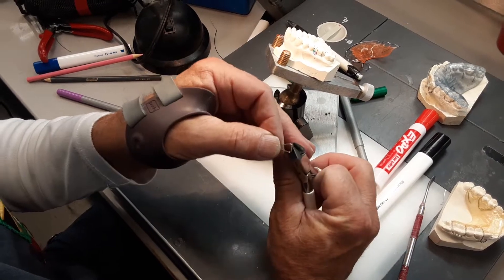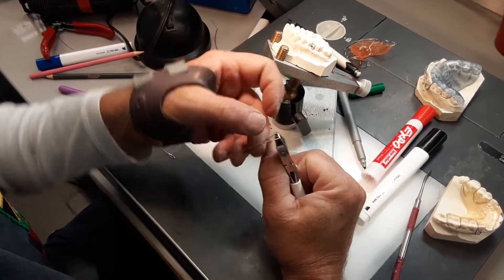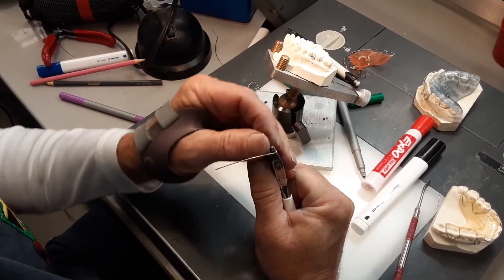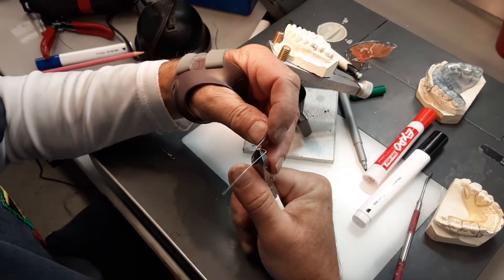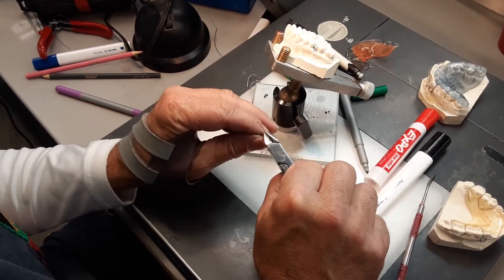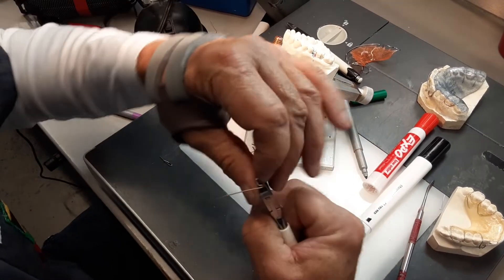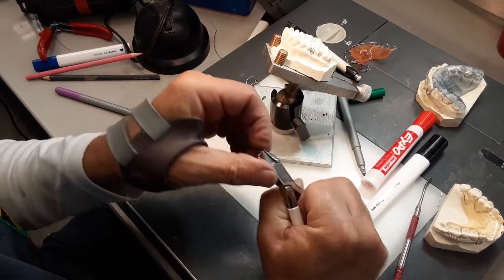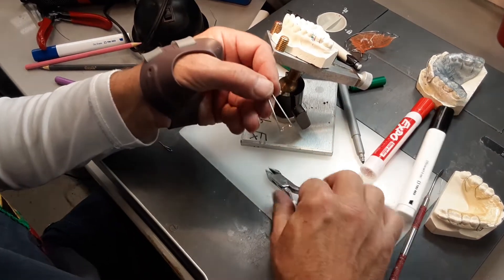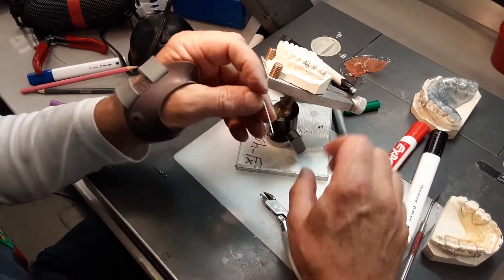I'm going to take my square beak, come on the inside. I'm going to get as close to the angle as I can, put my thumb in between them here, and make as small an eyelet as I can. Then coming over to the other side, I'm going to make sure the wire is perpendicular to the pliers and make the other eyelet again as tight as I can — the two wires should line up like that.